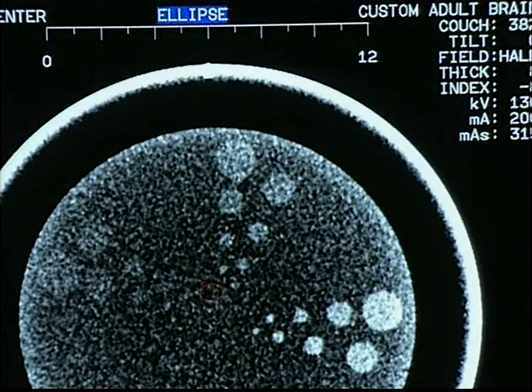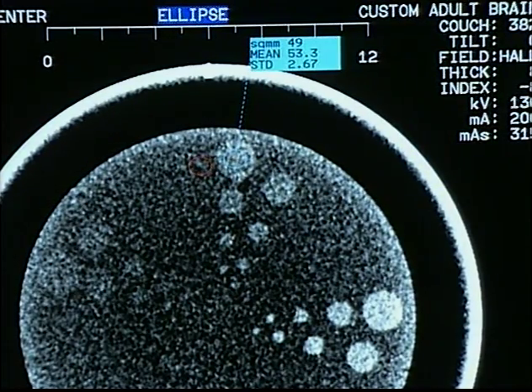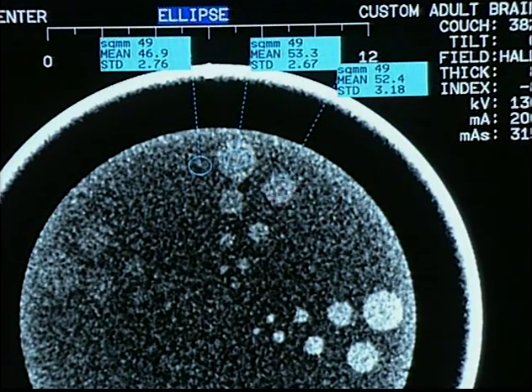The contrast variation is the difference between the background CT number and the test target CT number. It is important to take several ROI measurements of both the test target and its surrounding area and average them to reduce errors caused by the image noise and uniformity variations.